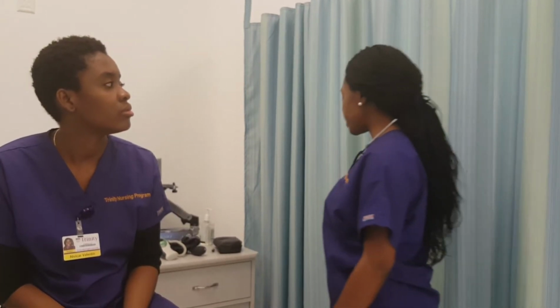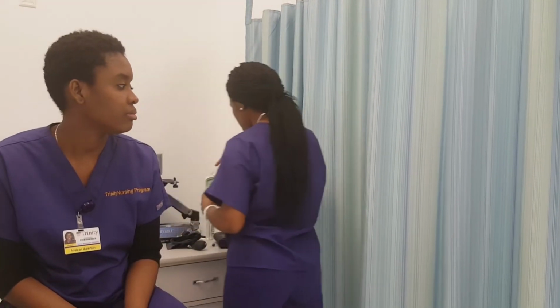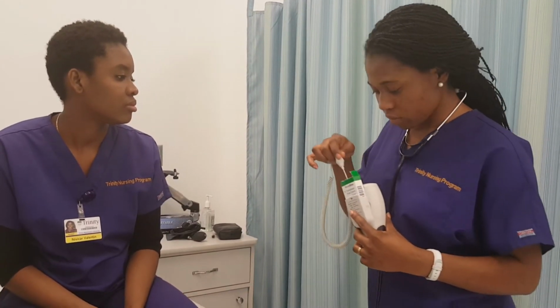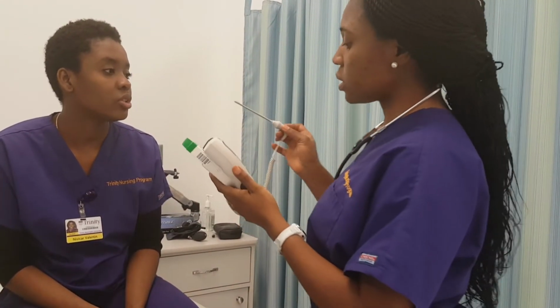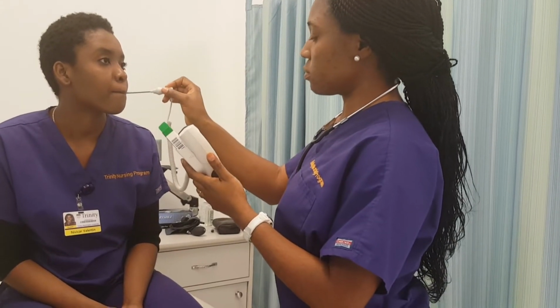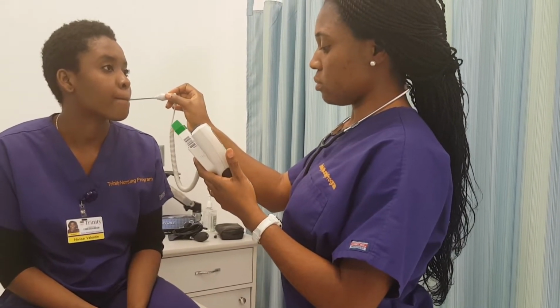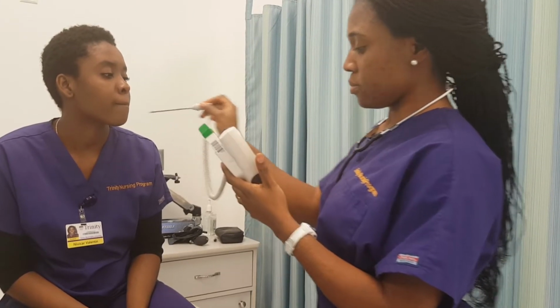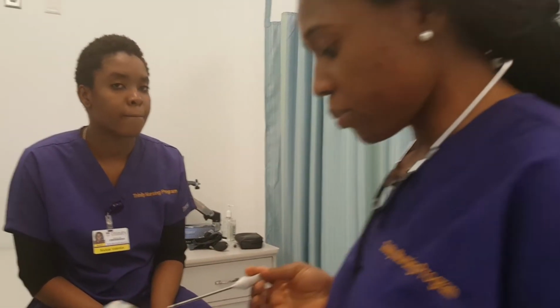So I'll go ahead and take your temperature. Okay. Can you open your mouth for me, please? Sure. So her temperature is 99.1.